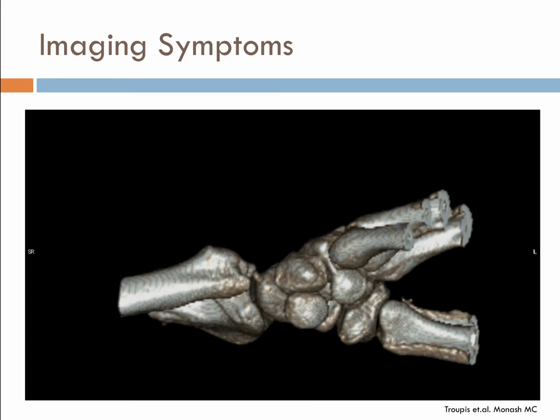Mainly, we use it in the distal or in joints like the wrist and the ankle, because naturally we apply radiation for a little bit longer while the patient's doing their action within the scanner itself, and so that does require a little bit more radiation. So a lot of the work to start off with has started on the wrist and the elbow. A little bit of shoulder work, it's always been done in the knee and ankle.